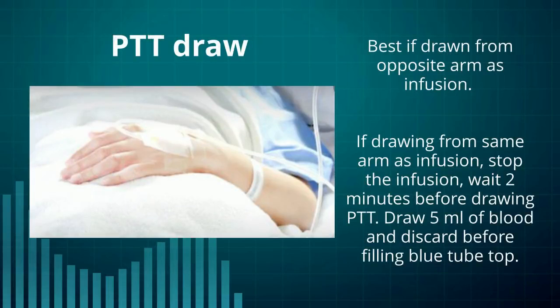It's best practice if you draw from the opposite arm of the infusion. If you have to draw from the same arm, stop the infusion for 2 minutes before drawing your PTT, and then discard a waste tube.